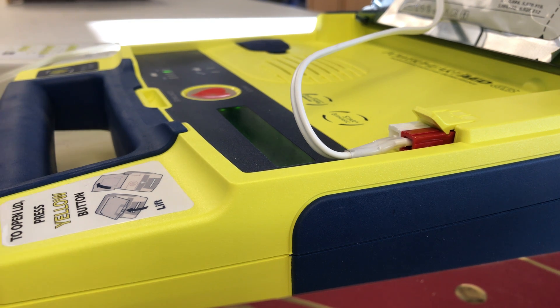When the patient's chest and torso are exposed, remove the square foil package from the lid of the AED. Tear open the foil package across the dotted line and remove the pads.